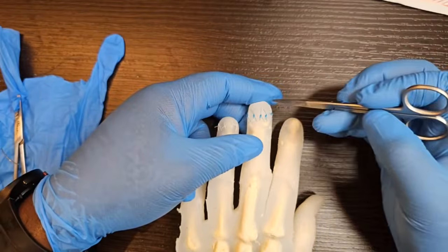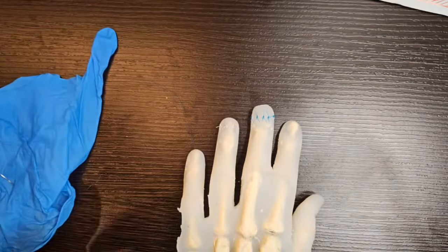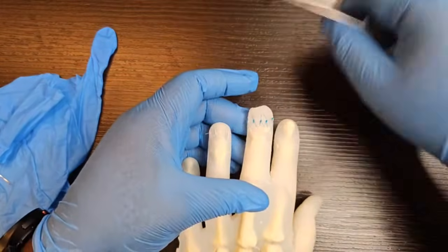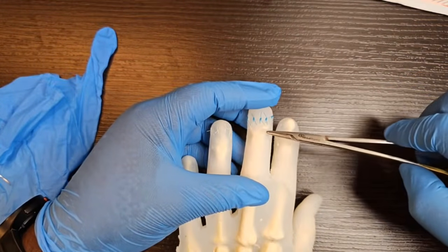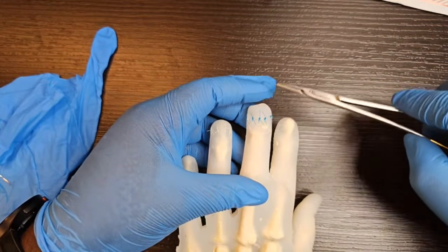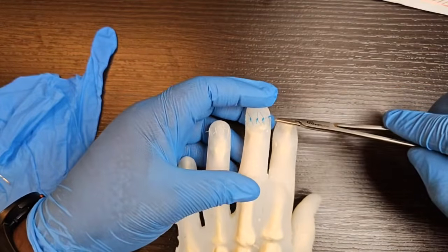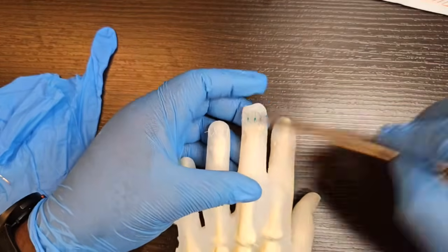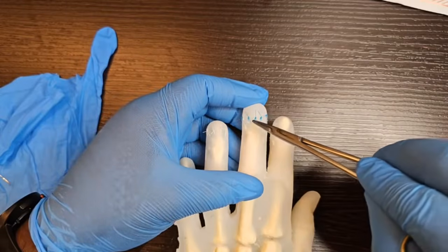You stitch from island to shore, because if you stitch from shore to island, you'll pull the tip off as you pull the suture. Same thing for a skin graft: you stitch from graft to normal, to stable skin, so that you stitch into normal and stabilize it. You start suturing nail bed injuries on the pulp side, which lines the nail bed up for you, and then you do the sterile matrix.